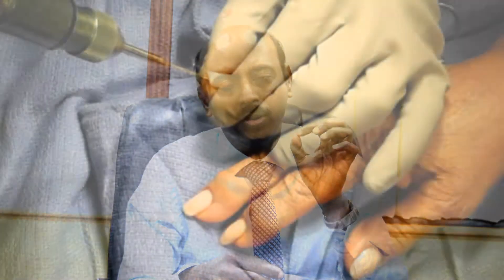When we say minimally invasive, it is something like laparoscopy. Similarly, without opening the fracture site, percutaneously using a small nick — like a pinhole procedure — you introduce this implant and transfix the fracture in good position. This is done under fluoroscopy. We have a fluoroscopy machine in theatre with which we reduce these fractures, put them back into normal position, and fix them.